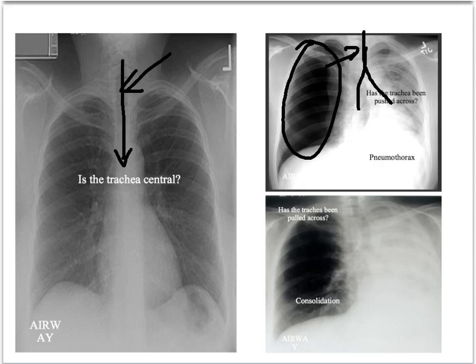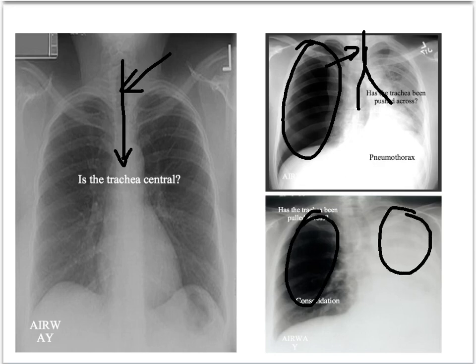Equally, the trachea can be pulled across. Here we have a normal lung on one side and a consolidated, more opaque lung on the other side. As a consequence, the trachea has been pulled across in that direction. If there is evidence the trachea has been pushed or pulled, you need to establish why — something abnormal is going on.